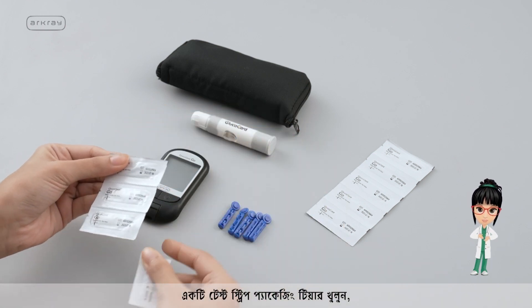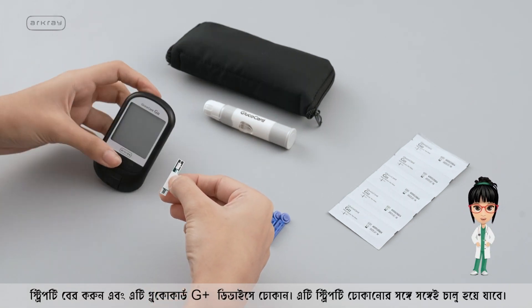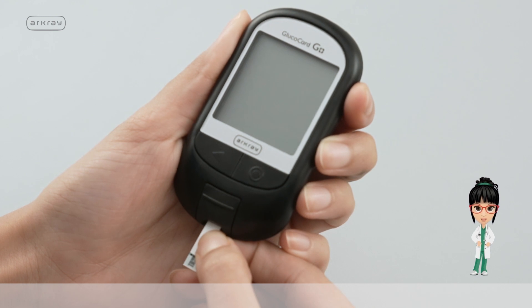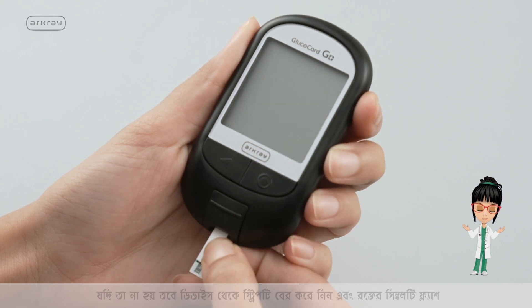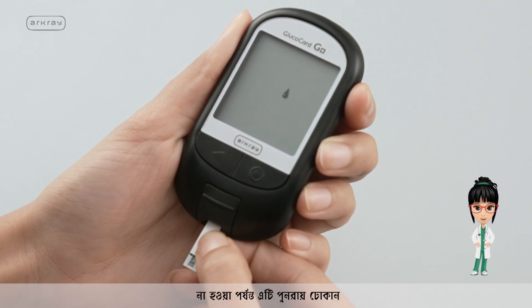Tear open one test strip packaging. Take out the strip and insert it into the Glucocard G Plus device — it turns on immediately upon inserting the strip. Ensure that the blood symbol is flashing on the device screen. If not, take the strip out and reinsert it until the blood symbol is flashing.